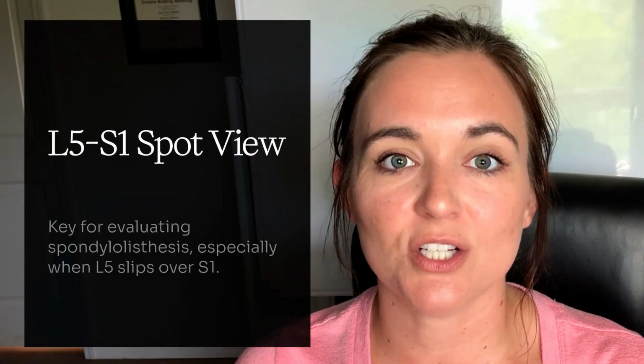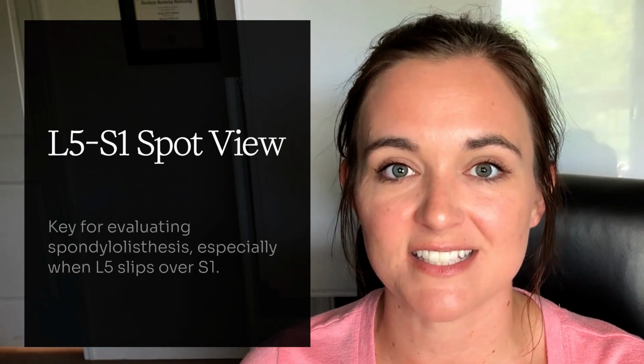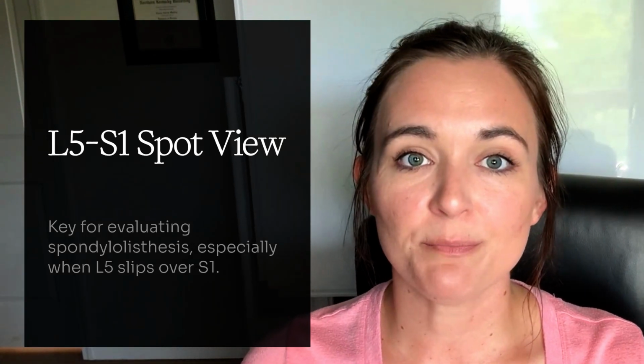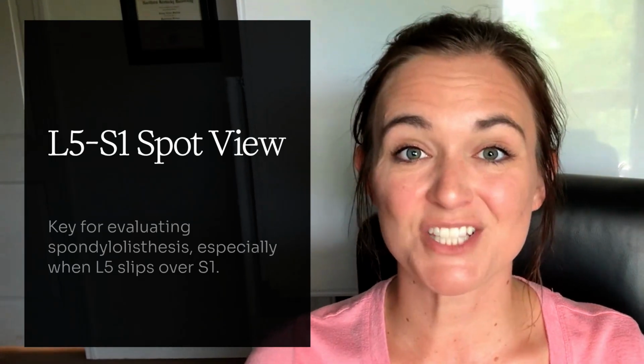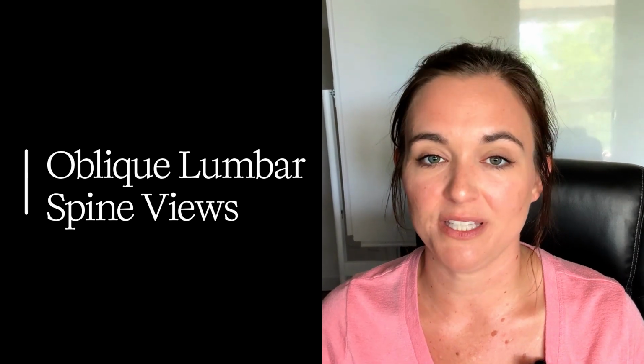Here's an ARRT clue. This view is key for evaluating spondylolisthesis, when L5 slips over S1. So don't be surprised if you see a test question asking which view best demonstrates that junction. This is the one. Okay, last in the routine series, we've got the obliques.